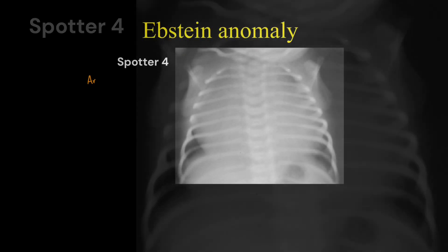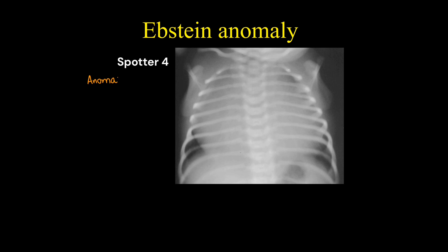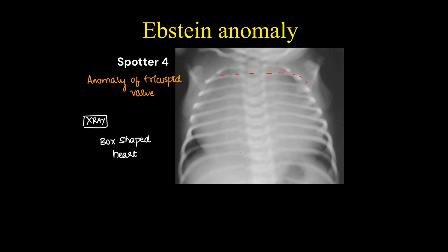This is a pediatric cardiac disease — Ebstein anomaly — in which there is an anomalous tricuspid valve. Usually the x-ray findings are variable and can be normal. But the classic sign described is the box-shaped heart, which can be seen in this x-ray, typical for Ebstein anomaly.